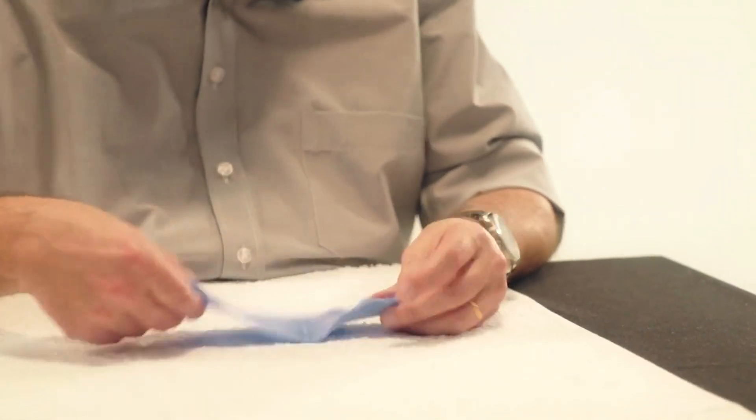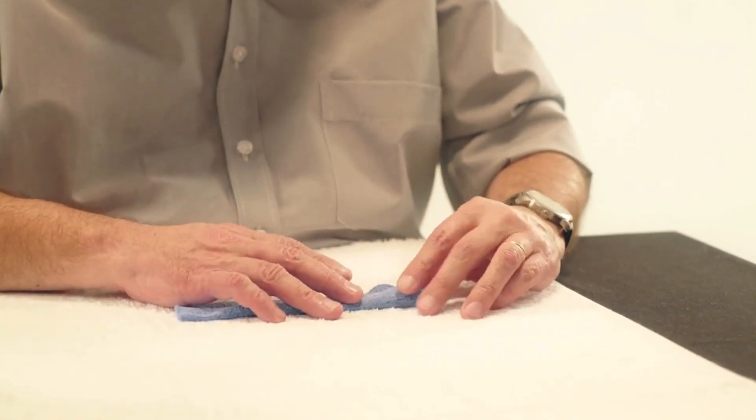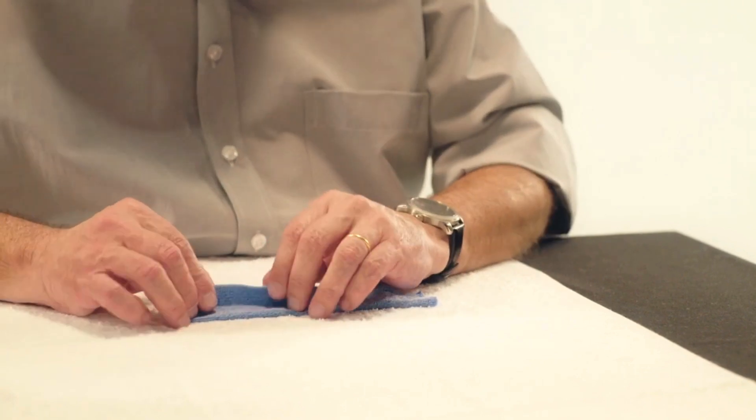Step 1. Heat the first strip of 20 cm and fold it in thirds lengthwise. Compress and lightly stretch the material.